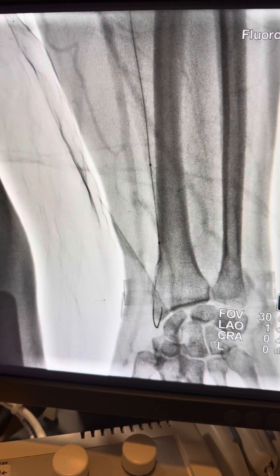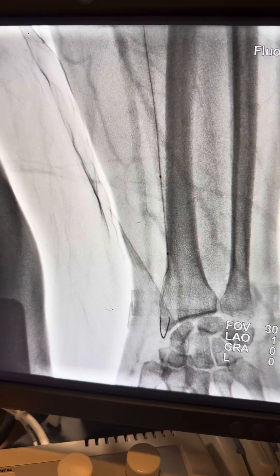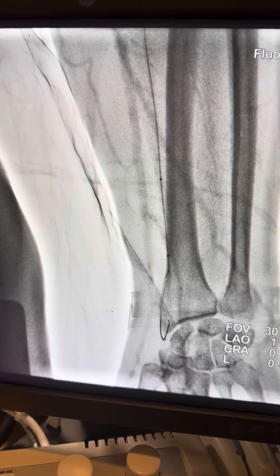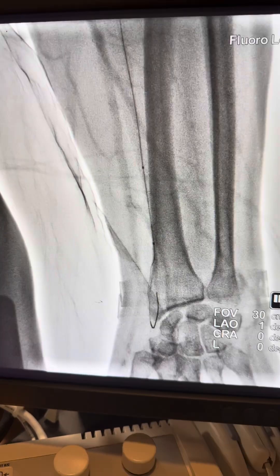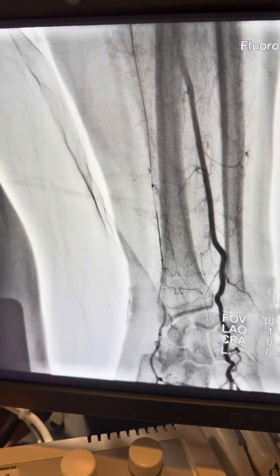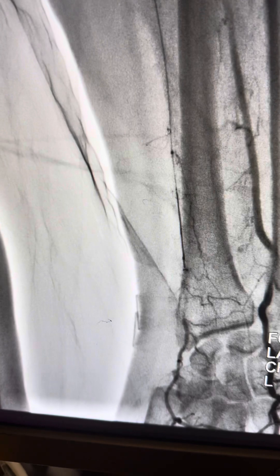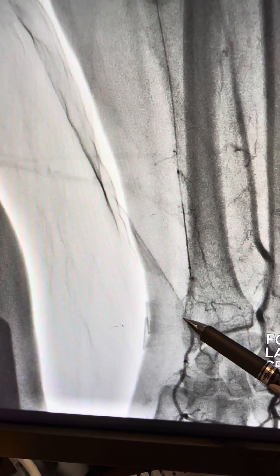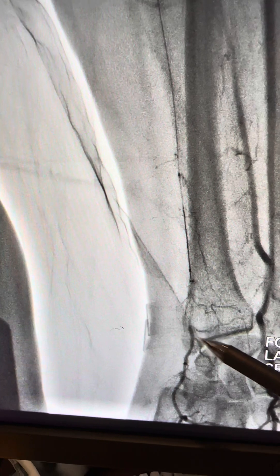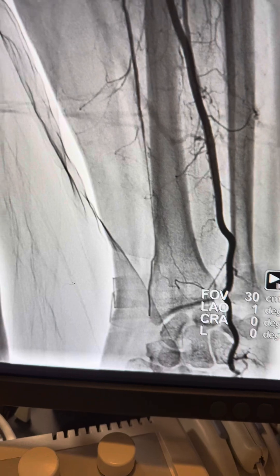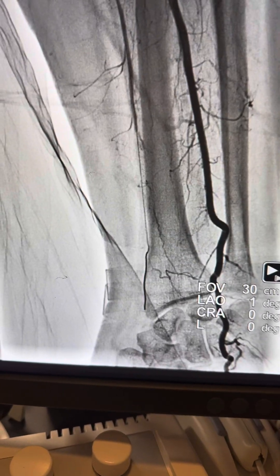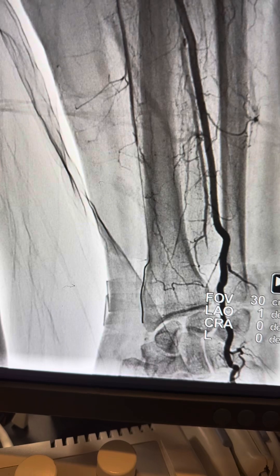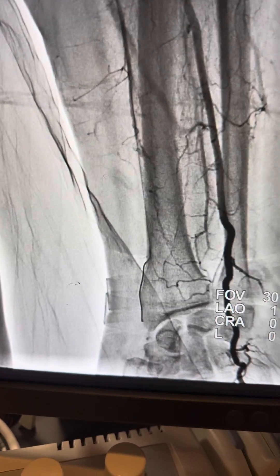The run-through wire appeared to pass distally, but it went through a small branch feeding the distal segment of the radial artery. Looking back at the prior injection, you can tell the run-through went through this small branch, making a loop toward the distal segment. The injection confirms still no flow distally — the run-through is not in the true lumen.